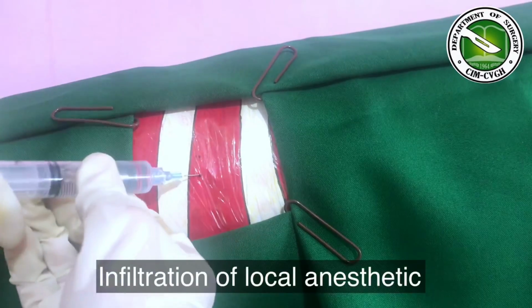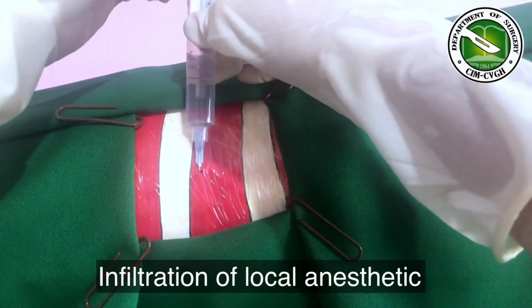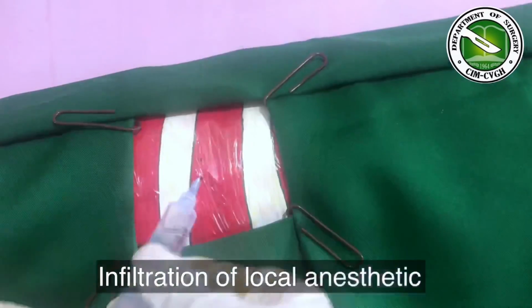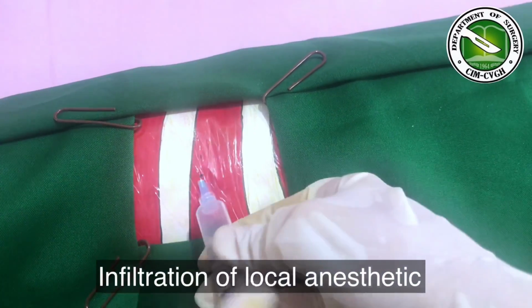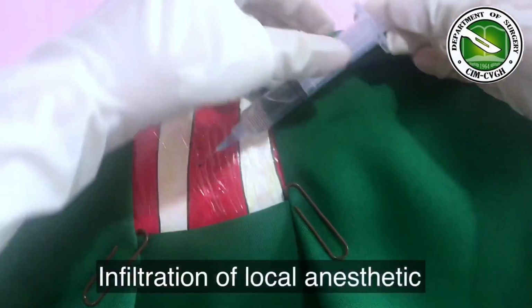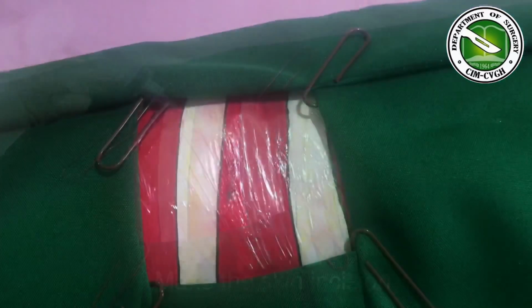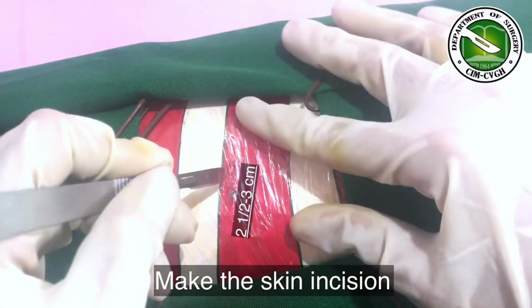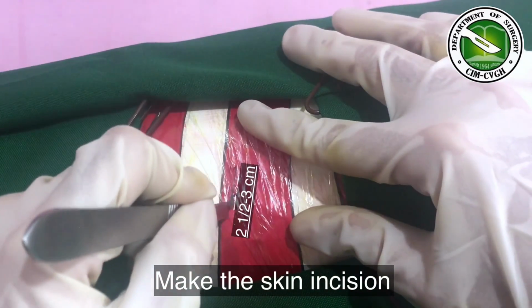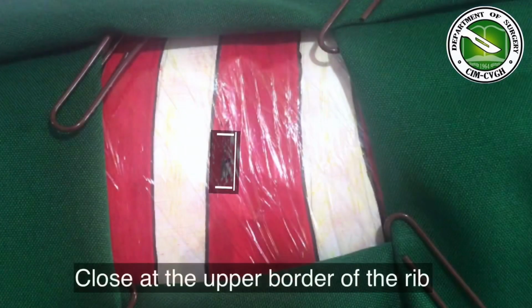At the fourth intercostal space anterior axillary line, infiltrate the skin with a local anesthetic and block the intercostal nerve branches. Do not forget to infiltrate the pleura. Check the effect of the local anesthetic. Make a 2.5 to 3 cm long skin incision well into the subcutaneous tissue. The insertion site of the chest tube must be as close as possible at the upper border of the rib.